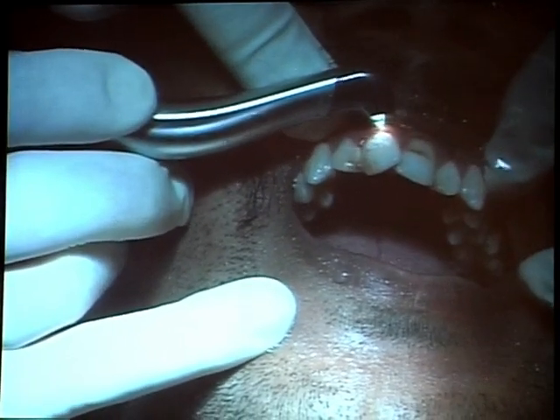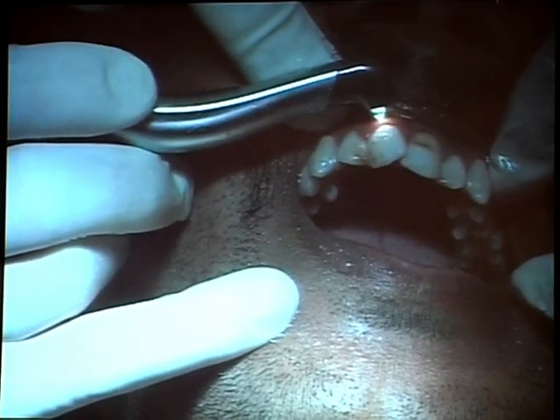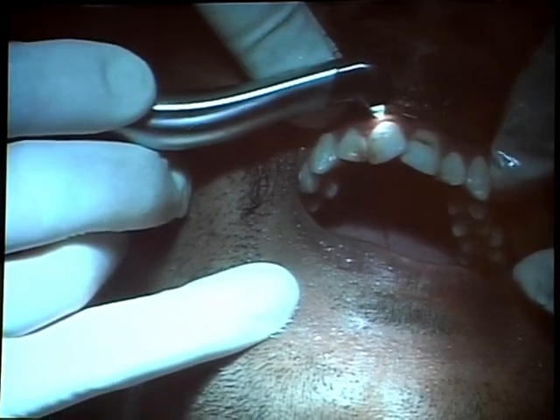And now we are going deeper on the surface and we are approaching the gingiva.